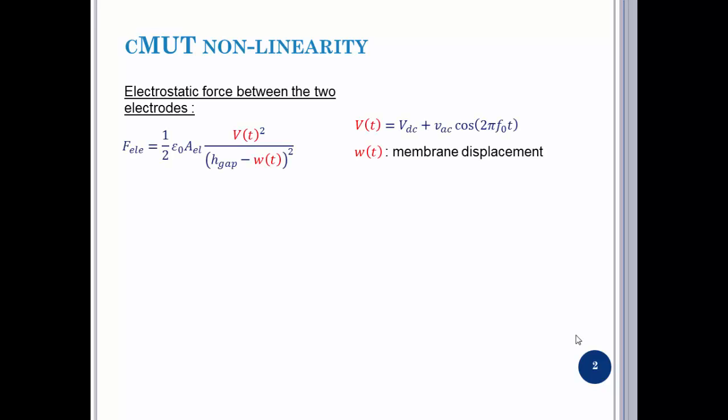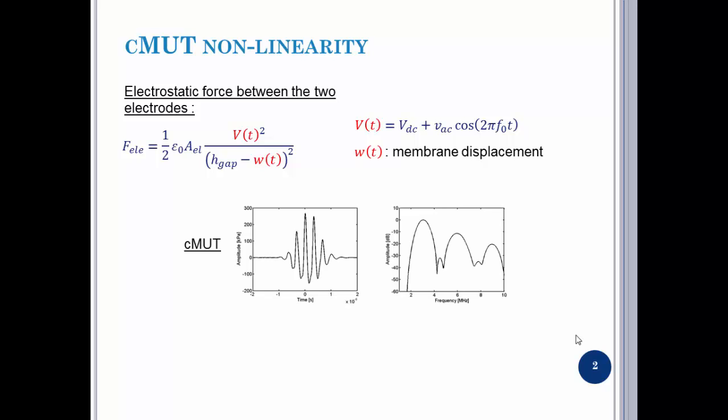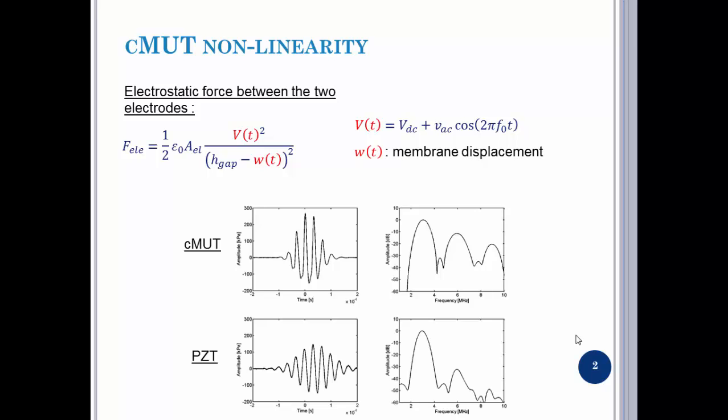I would just state at this point that the electrostatic force depends on the square of the tension. So if you look at a simple case, the pressure measurement with a hydrophone, you can see a lot of harmonics, and compared to the piezoelectric case, the harmonics are very much below that. I think this harmonic mainly came from the nonlinear propagation in water at this kind of pressure level. So this could lead to some issues.